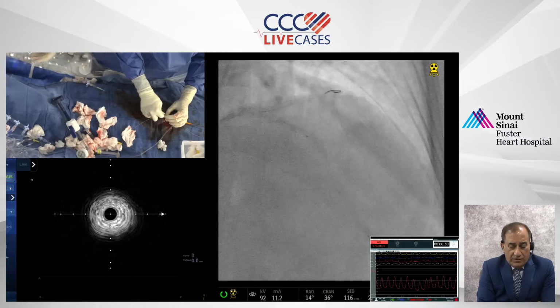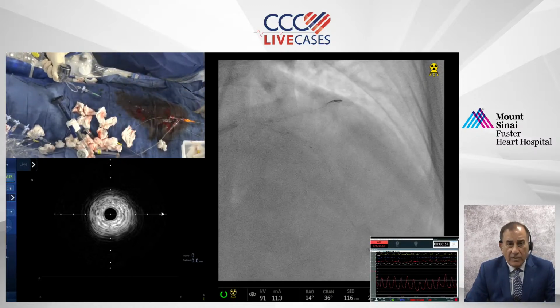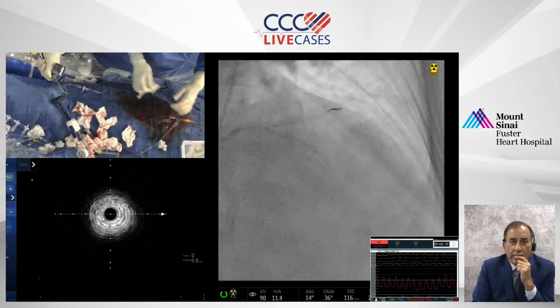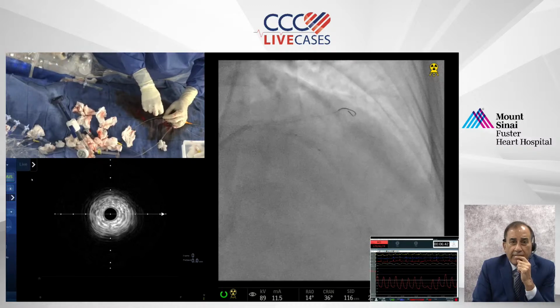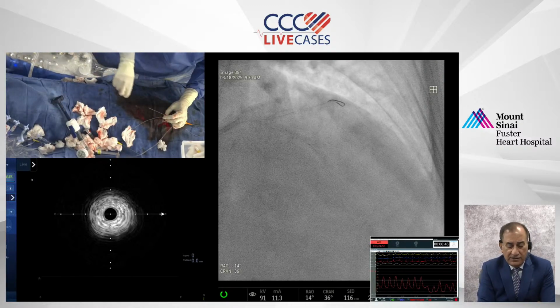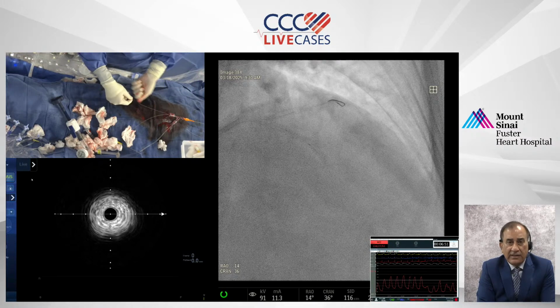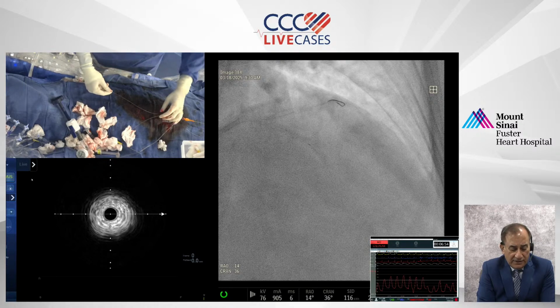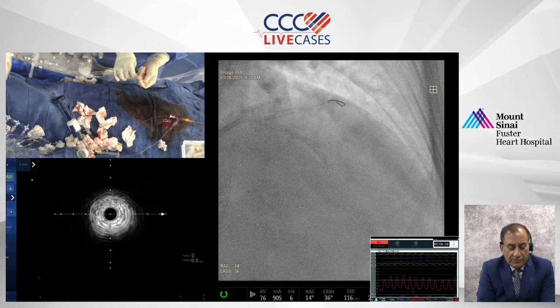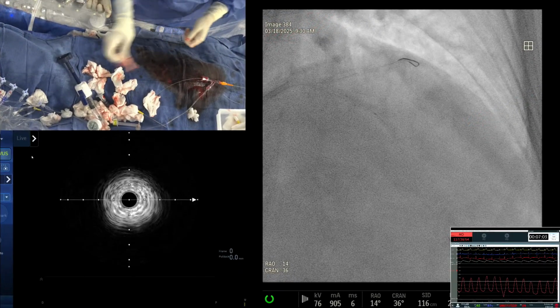But yes, once you go, it's a great one. It will open up your IVL or anything which will not open, because you go to 40 atmospheres with a different balloon inflator. It's a very good device. Lovely complement to our discussion. It just completes the entire academic exercise. Daniel, thank you so much for pointing it out, and a pleasure. I think we are about done now. Once we open up with this balloon, we just finish the kissing and that's the end of our presentation here.